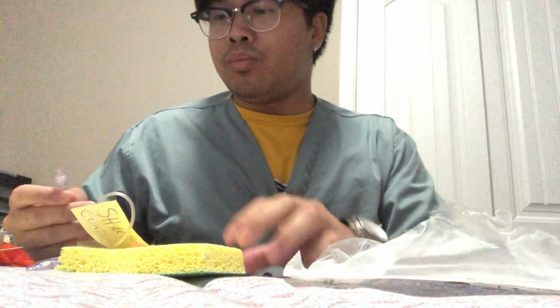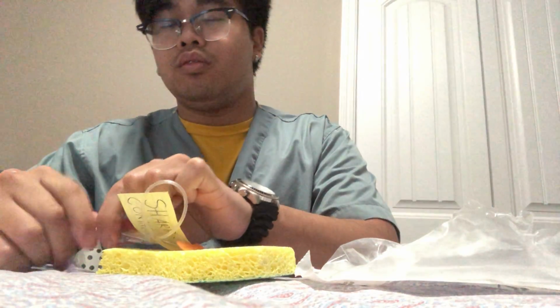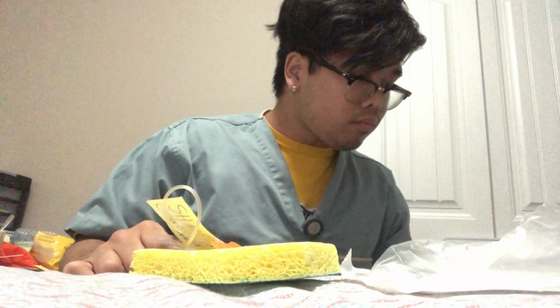I'm also making sure that this tip is clean. I'm applying alcohol swab on it, and then I connect it here. There, just like that.